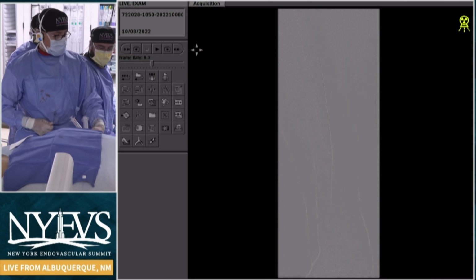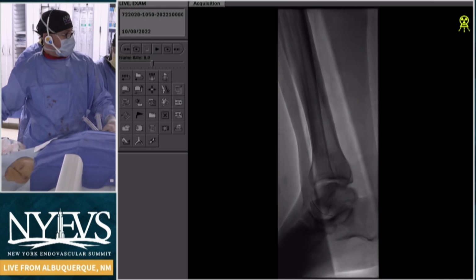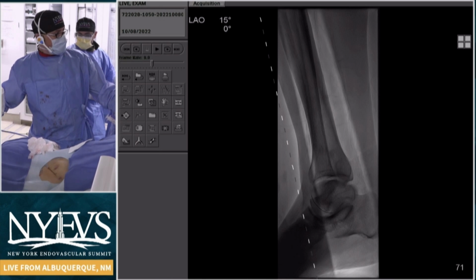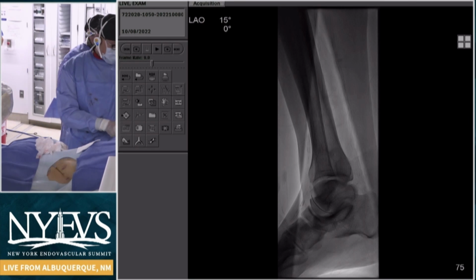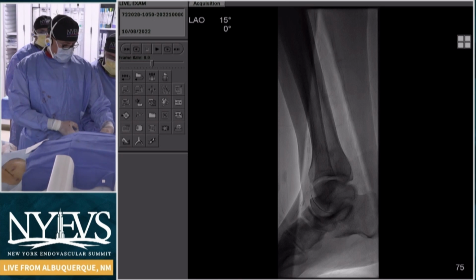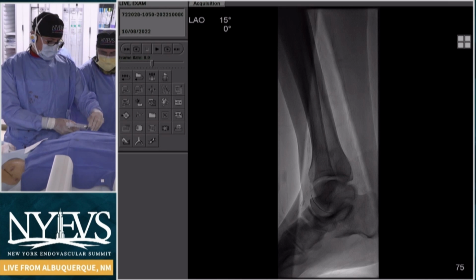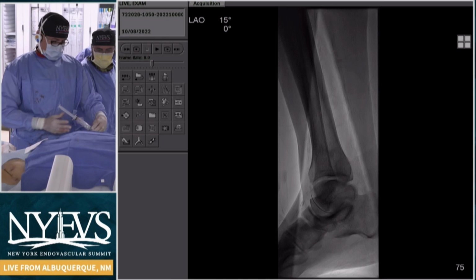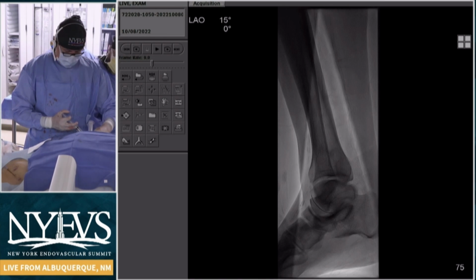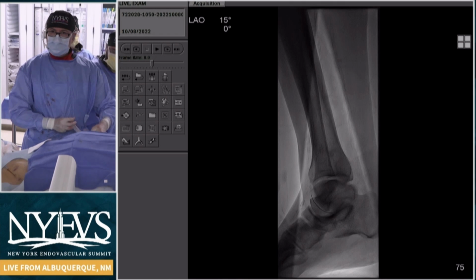And I know you all talked about Dr. Coombs' data regarding the time component after DVA, and I think it is, as you alluded to, applicable to these cases. Yeah. So I think I'm at the point now where I may be pretty happy with what I'm going to get, and we've seen that too, Steve, in our CLI population. I've had quite a few podiatrists over the years call me at about the 2-week mark and say, "This wound is not healing. It's not getting better. I'm worried." And we'll do the angiogram, and all the small vessels have really plumped up at about that 1 to 2 week mark, and you'll be amazed how much your perfusion has significantly improved, and you just have to wait and give it time.